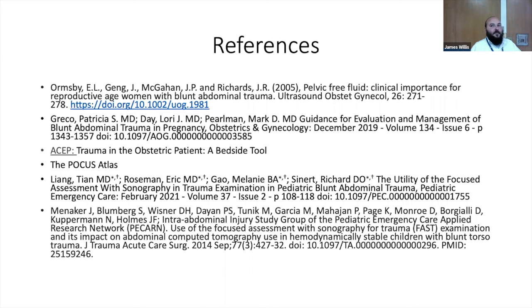If you're a surgeon, you're going to open somebody up, you want to know what you're opening up. Saying that there's free fluid doesn't really tell them anything. It's a surrogate. So for the unstable patient, you're like, well, we don't have time to figure it out. This patient's got to go to the OR if their FAST is positive. But if their FAST is negative, then you got to say, okay, where is the site of their injury that's making them unstable? But in a stable patient, if you have any concern for injury, you're going to get a CAT scan because that's going to give you much better information.